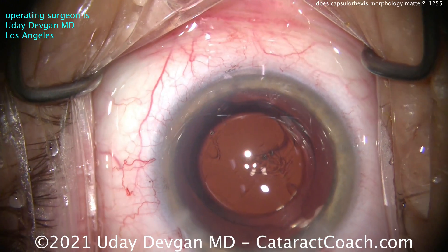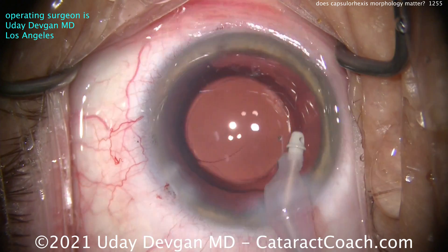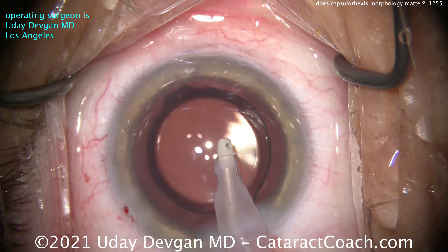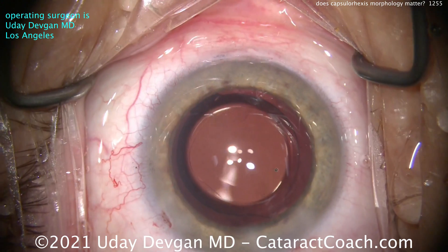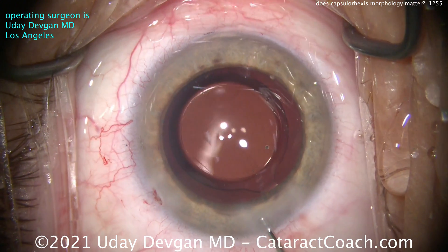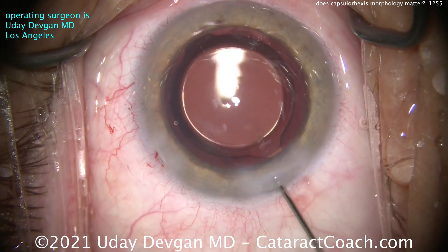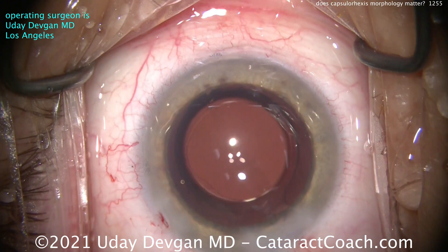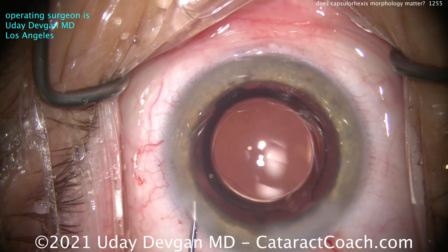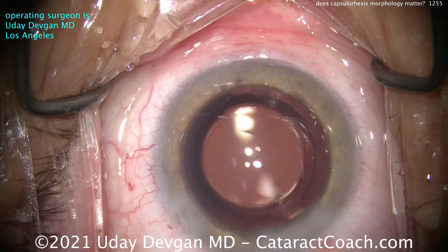Sealing up the incision — you can see there's still some viscoelastic in the eye. Definitely don't want to leave that in, as it's going to cause a pressure spike. So go back in with the I/A probe and clean that up. I'm really liking the position of this lens — it's nicely lined up. Remember, this lens has that central one-millimeter increased curvature on the optic, which you really cannot see at the microscope, so you just have to set up the Purkinje image as best you can. There's the end of the case. Rhexis morphology is important to a degree, but don't be so hard on yourself.